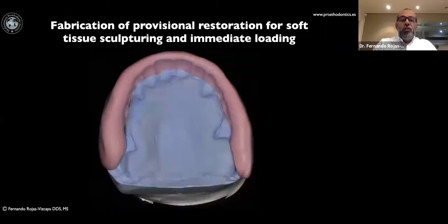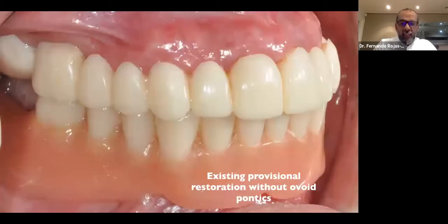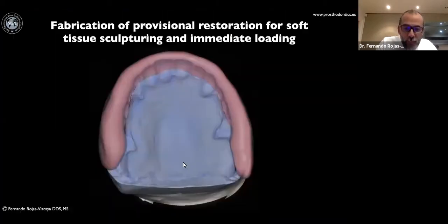Okay, so now I take an impression of this situation with the same prosthesis and create a model. I take the impression and make a pickup. I put light silicone in the prosthesis to copy exactly the anatomy, and then an alginate impression, and I make 2 or 3 models with the new existing anatomy, and make a silicone index of the existing prosthesis with the margin. And you can see that we are ready with the margin for the ovate pontics of the central, lateral, canine, but not for the premolar.